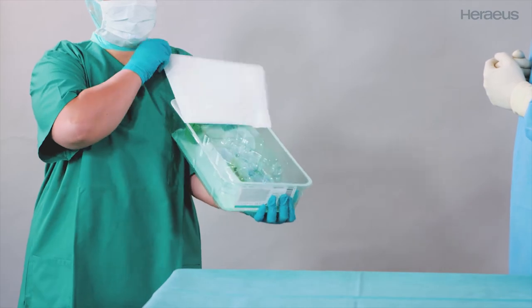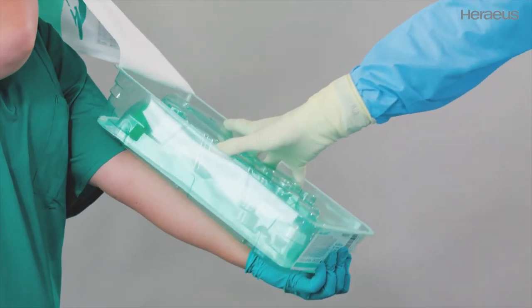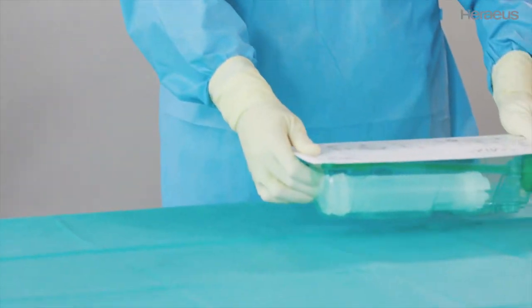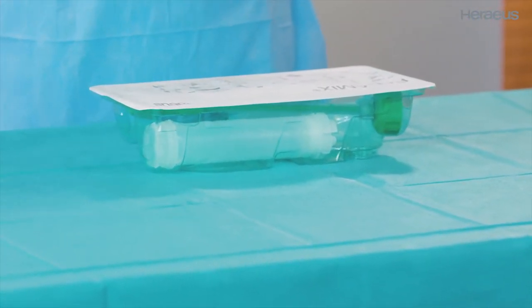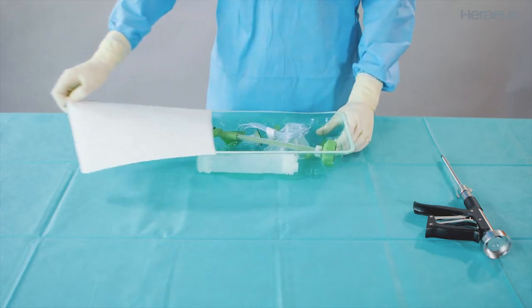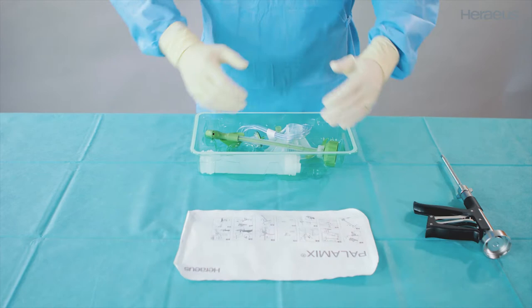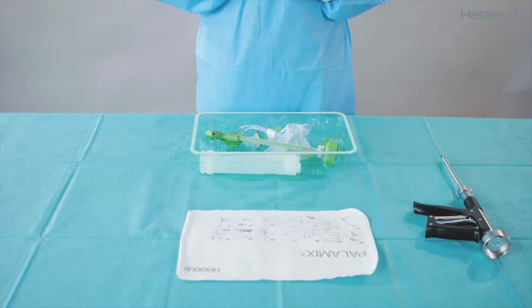Open the non-sterile outer blister and hand over the sterile inner blister. Place it on the sterile table with the labeled Tyvek facing upwards. Open the inner blister and use it as a tray. Place the Tyvek on the sterile table — it includes instructions for the next steps and can be used as a step-by-step guide.